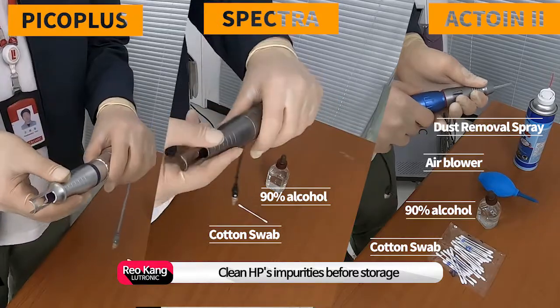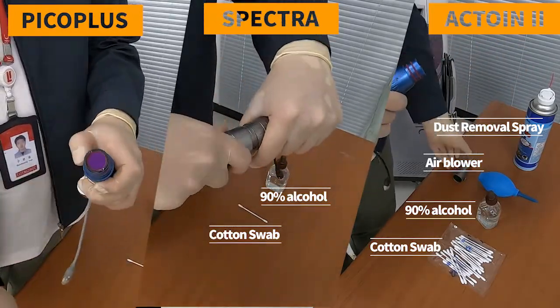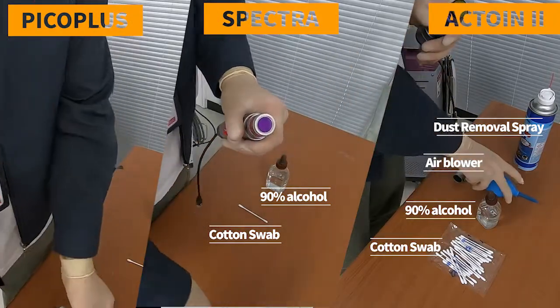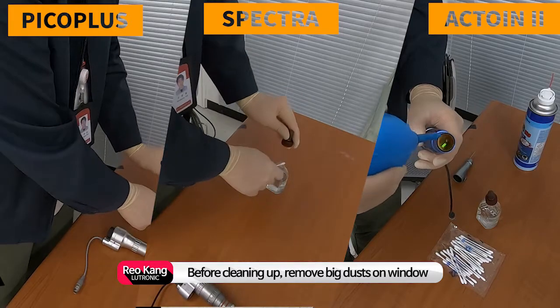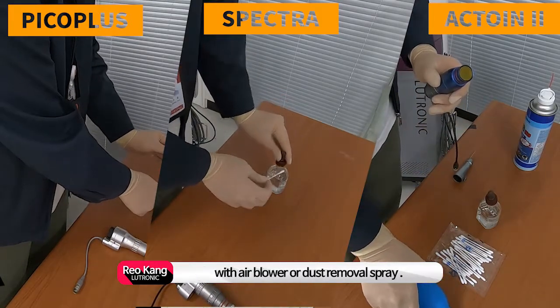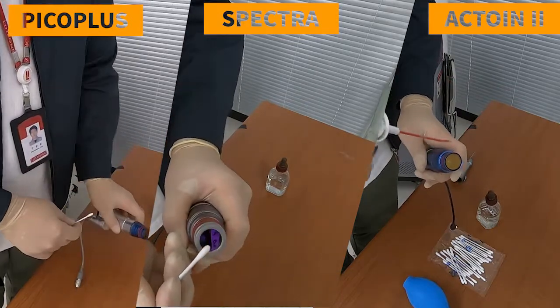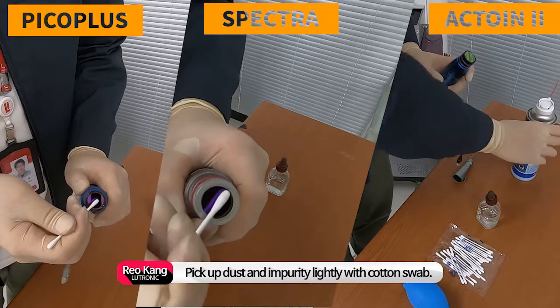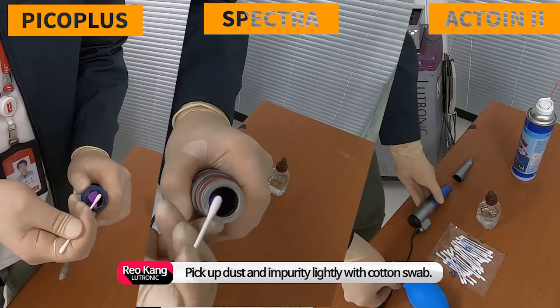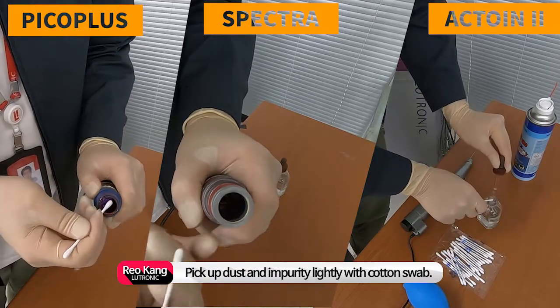Clean handpiece impurities before storage. Before cleaning the window, remove big dust with an air blower or dust removal spray. Please do not rub when cleaning the window — use a cotton swab and alcohol, and just pick up dust and impurities lightly with the cotton swab.